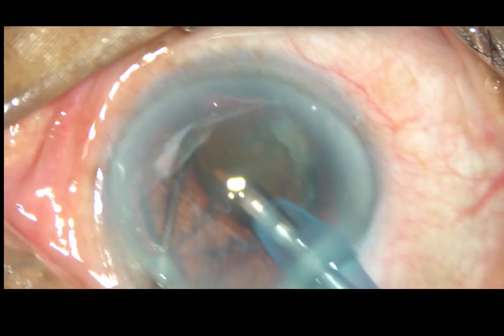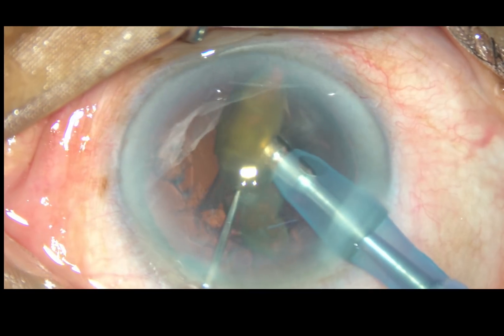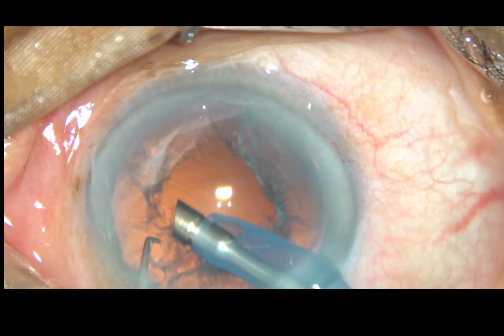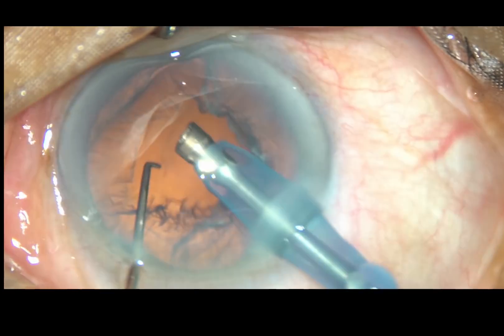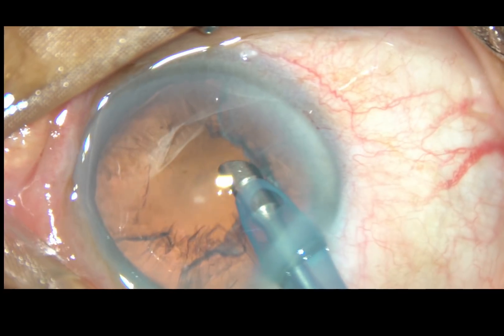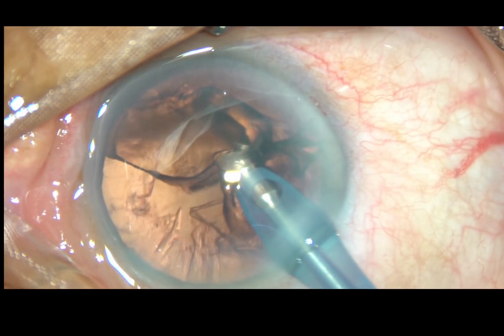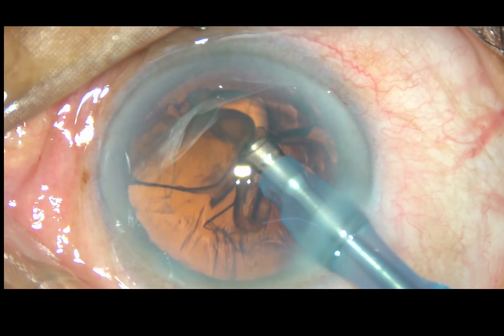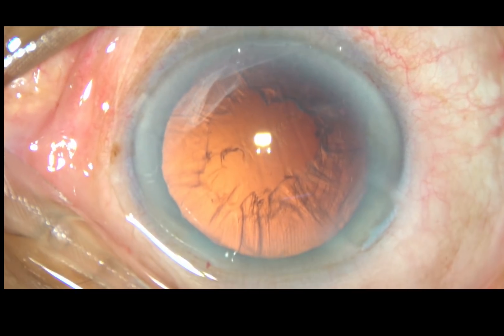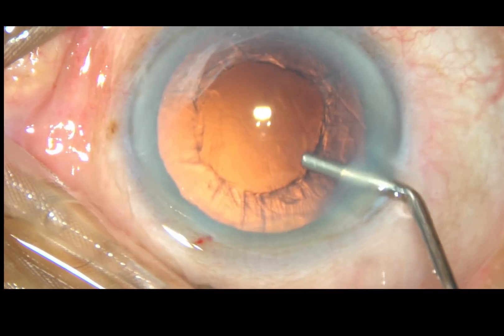Ultrasonic power used is only 40%. This is the last nuclear fragment — it is emulsified and removed. In this case, I can see there is thick epinucleus, and the thickest part is towards 7 o'clock. So I turn the tip towards 7 o'clock. At this time, no ultrasonic power must be applied — just by vacuum, hold the epinucleus, bring it to the center of the anterior chamber at the iris plane and emulsify. At no time should the tip come anteriorly. Emulsification should be done at the anterior capsular plane and not come anteriorly beyond the iris plane.